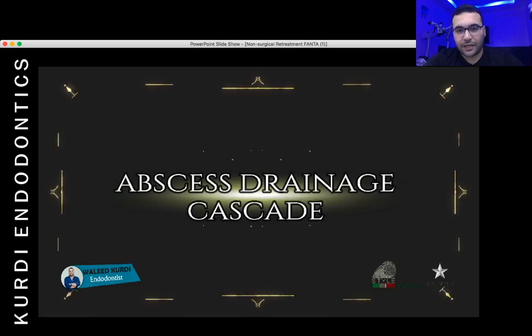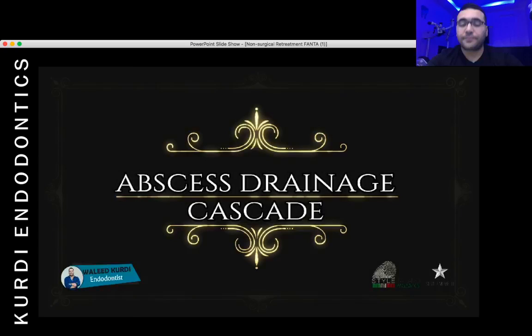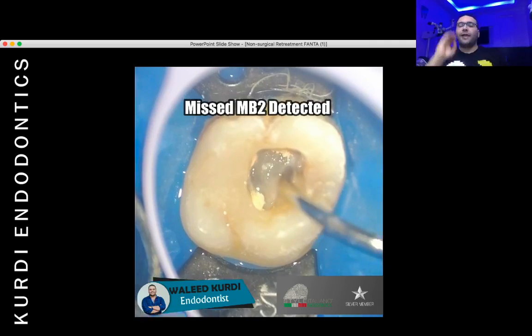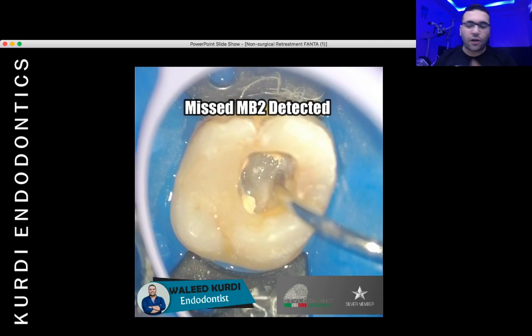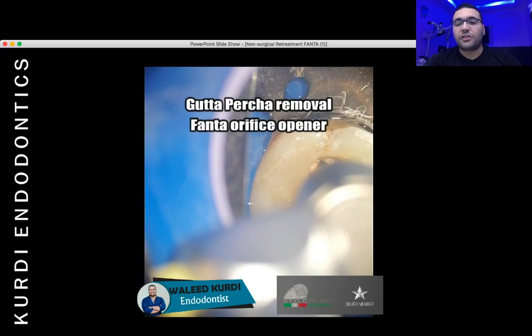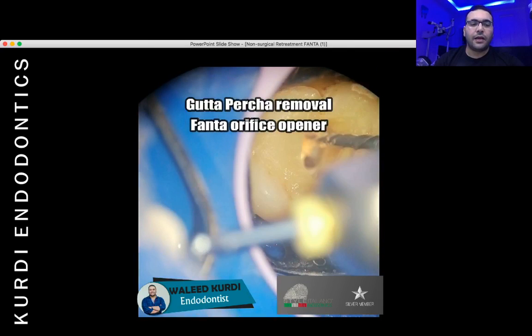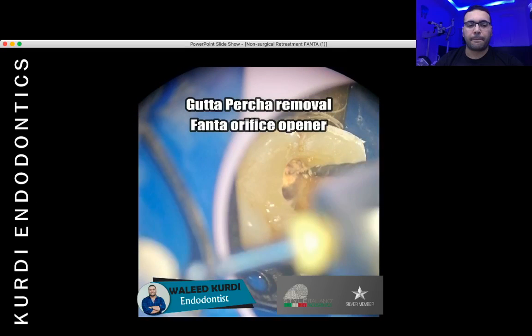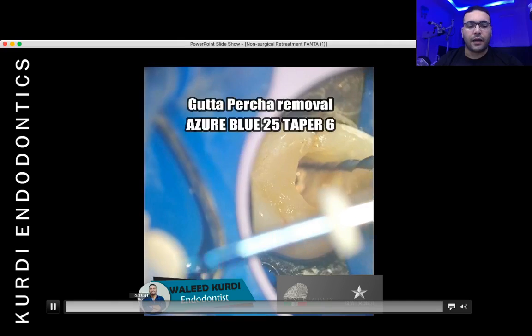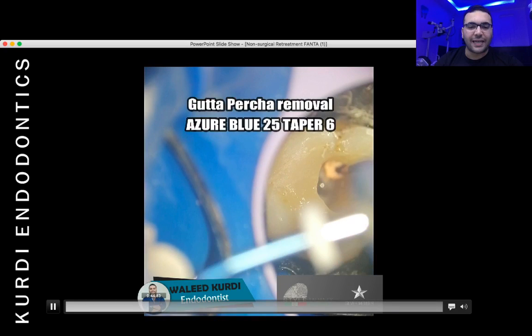Now another video here. It was very well obturated, but 6 years ago, and there was a composite restoration, but the composite restoration was very bad and leakage happened because of the bad coronal restoration.